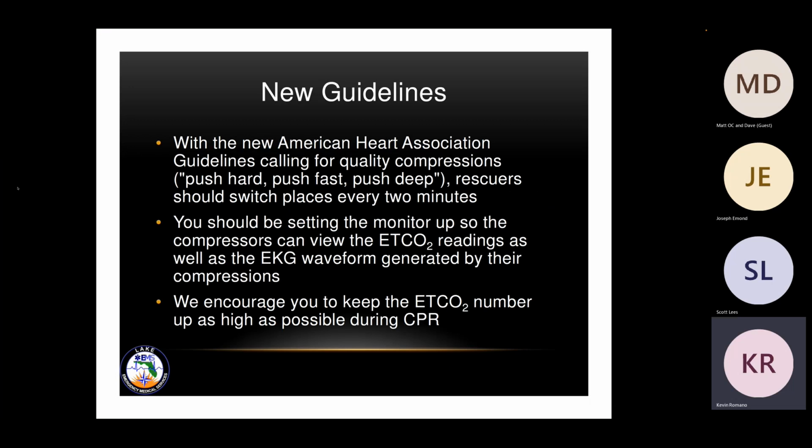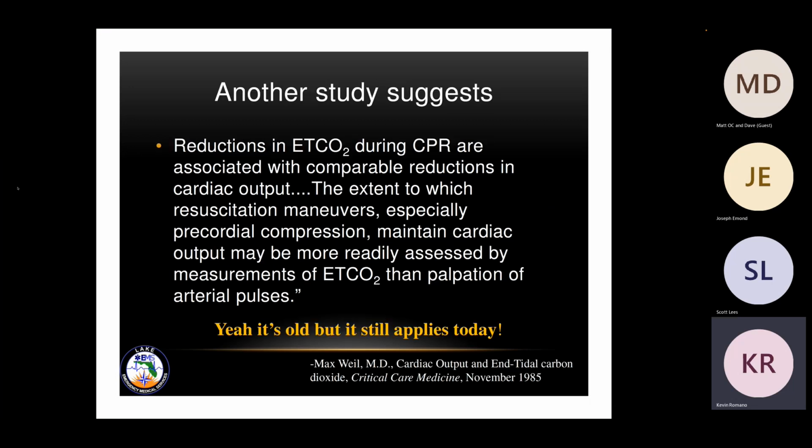A little too fast there. Another study suggests that reductions in end tidal during CPR are associated with comparable reductions in cardiac output, to the extent which resuscitation maneuvers, especially precordial compressions, maintain cardiac output may be more readily assessed by measurements of end tidal than palpation of arterial pulses. Yeah, it's old, but it still applies today.